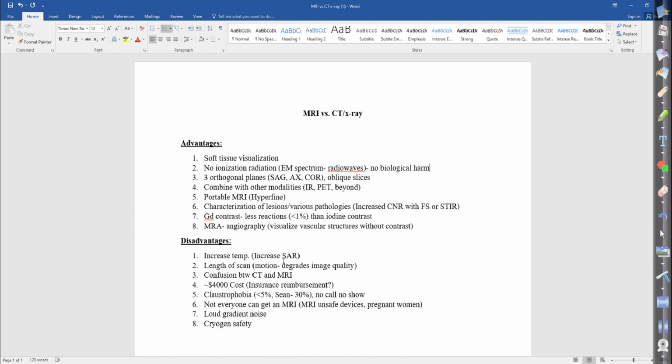In terms of the frequency of that electromagnetic wave, what do you think? Do you think ionizing radiation has a higher frequency or radio waves? Ionizing has a higher frequency.